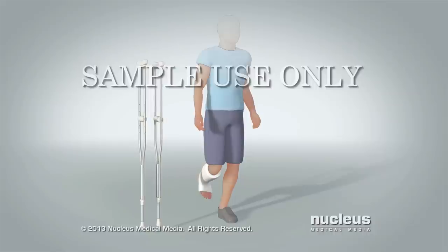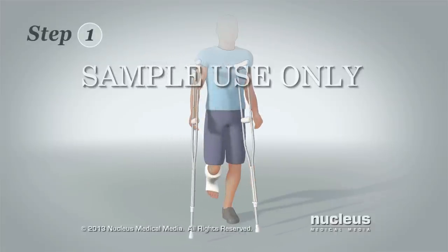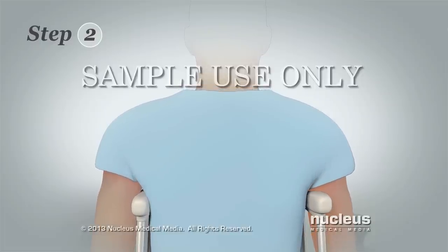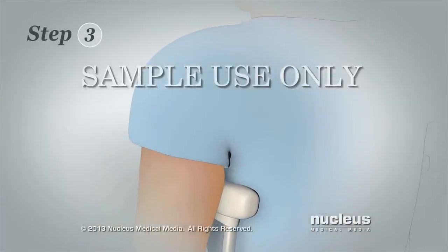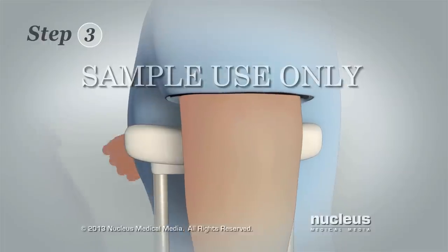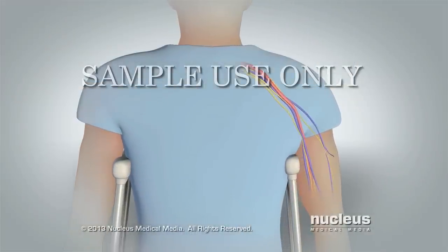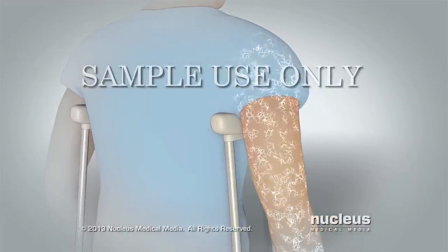Before you use crutches, you will need to make sure they fit your body correctly. Step 1: Put one crutch under each arm at the sides of your body while you're standing. Step 2: Relax your shoulders and let your arms hang down over the crutches. The crutch pads should not touch your armpits. Step 3: Check the amount of space between your armpits and the crutch pads. There should be 2 inches or 5 centimeters of space — about 2 or 3 finger widths. This space helps keep the crutch pads from putting pressure on nerves and blood vessels in your armpits. Pressure on these nerves and blood vessels may cause arm tingling and weakness.